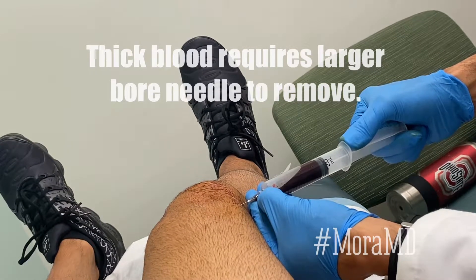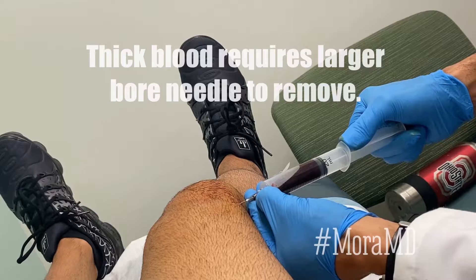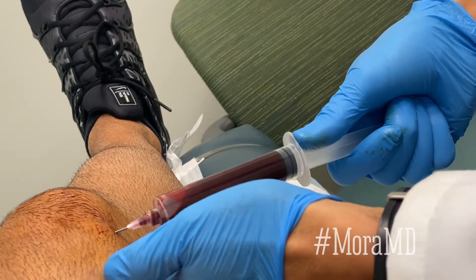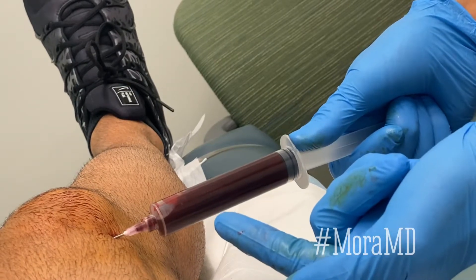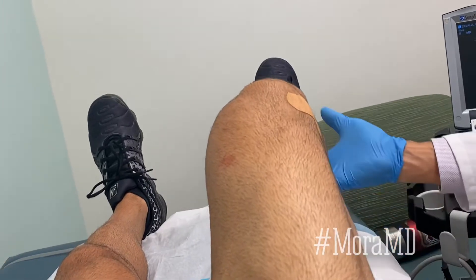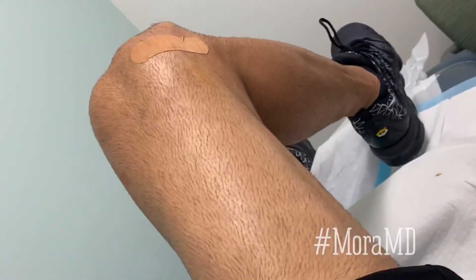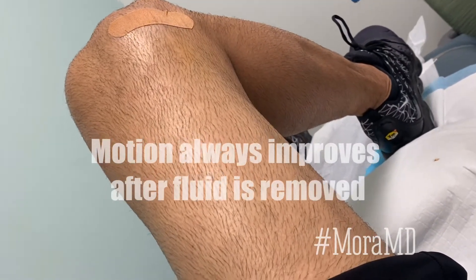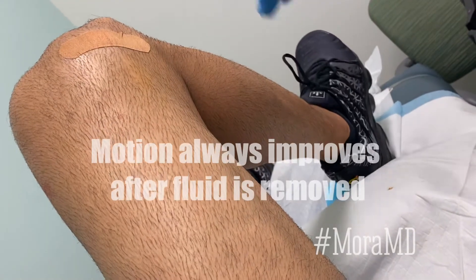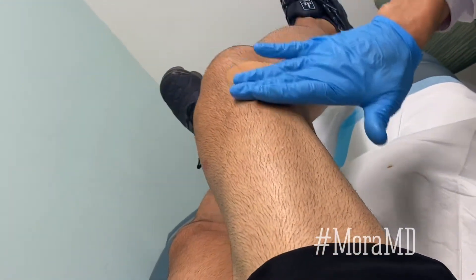If there is some sort of tear, fracture, or a loose body, we don't want to cloud the clinical picture, because the information we get over the next few days will be important. Now the syringe is full. Go ahead and bend it for me if you can — a little bit of fluid in there, but he's at 95 degrees easy. Before, his foot was way over here, so that's an easy 95 without a lot of stress on it. Nice and supple.